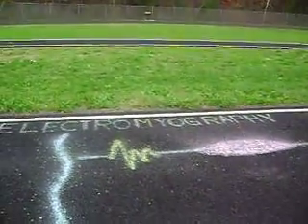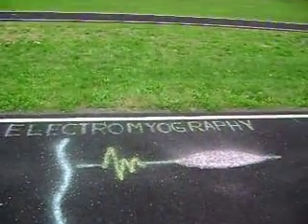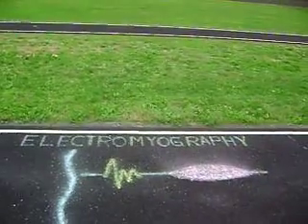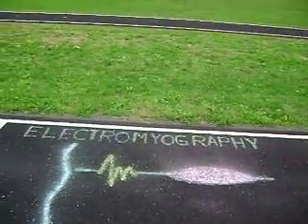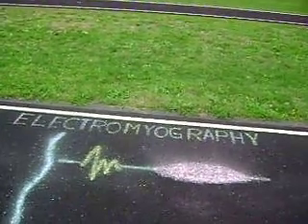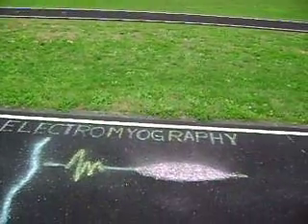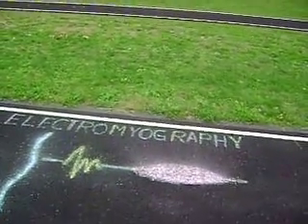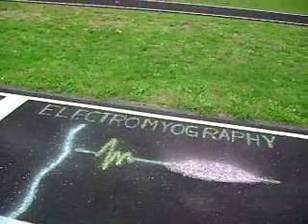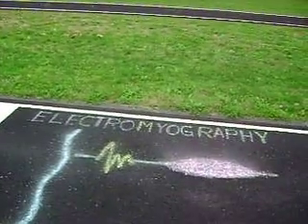The electromyographic needle examination records electrical activity in muscle, yielding information on the nature and location of motor unit disorders. Changes in insertional, spontaneous, and voluntary activity may help in differential diagnosis. Abnormalities on needle examination may occur in many combinations. No single abnormality is specific for a given disease.